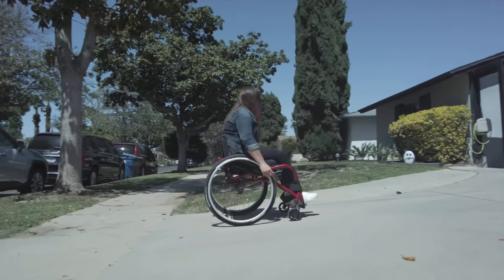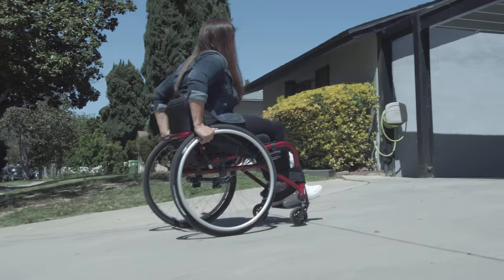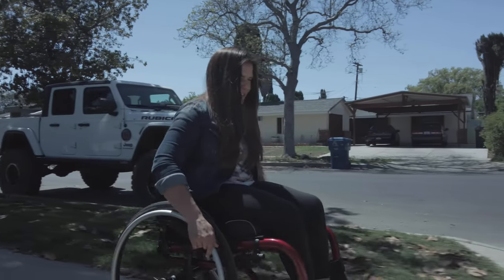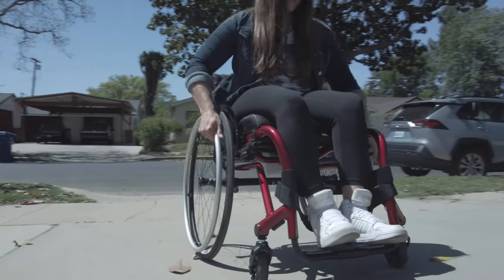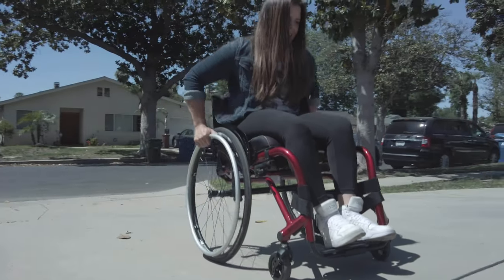That's the transport weight you're working with when getting in and out of your vehicle. One of the main features introduced with the Nitrum is a flip-back side guard option. Traditional aluminum side guards are usually fixed, but with this option, if somebody is trying to transfer side-to-side, you can easily push back the side guard, freeing the entire area to move side-to-side during transfers.